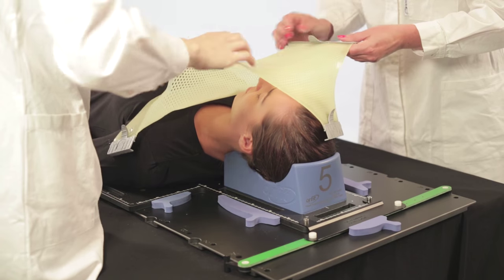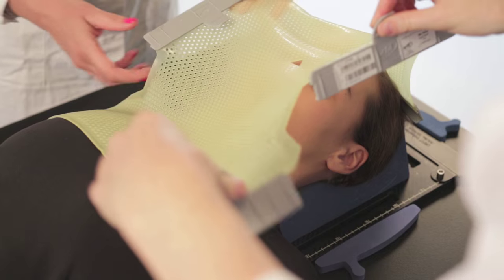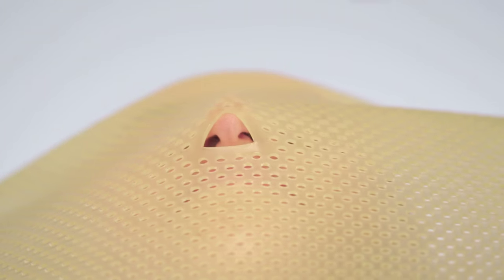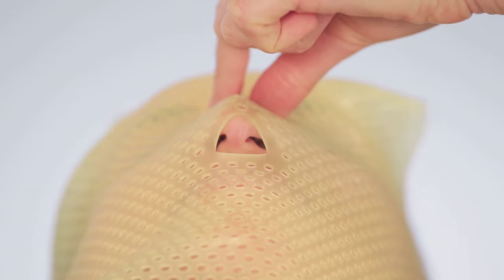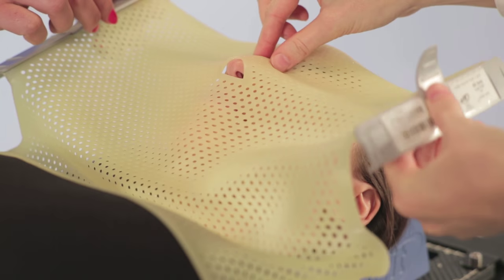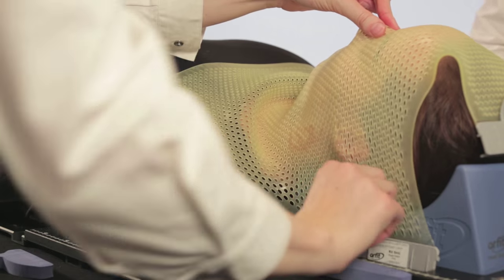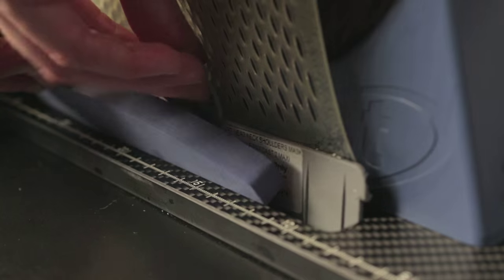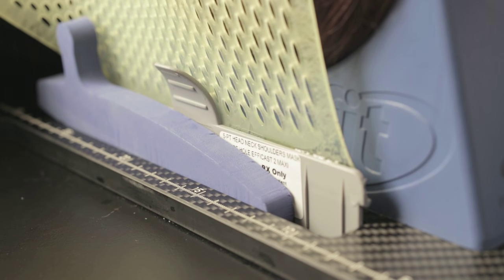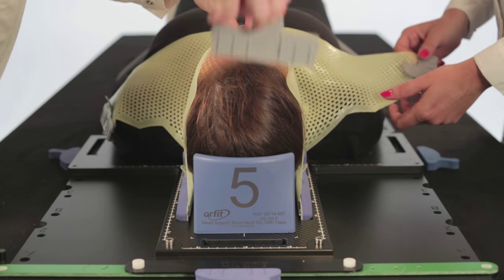Pre-stretch the mask slightly before securing it to the base plate. Position the pre-cut over the face of the patient with the top of the nose hole on the tip of the nose first. Insert the two lateral L-shaped profiles into the base plate and secure them in the slot with a foam handle of the appropriate length. Hold the material at the nose and stretch the cranial flap.